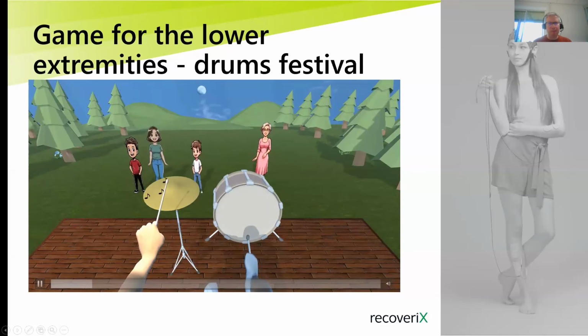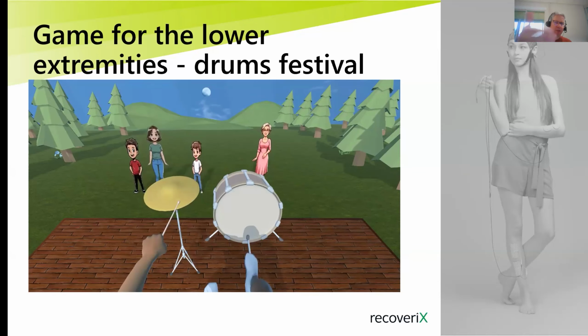So this is a feedback about your performance. If you're playing well, if you're always hitting the instruments in time, then over time more and more people will appear. So the crowd will be just bigger and bigger, and they're all of course happy and listening to your music. If you would play not so good, if you would miss some beats, then persons would be disappointed and they would disappear again, go back to where they came from. So this is an online feedback of how good you're performing.